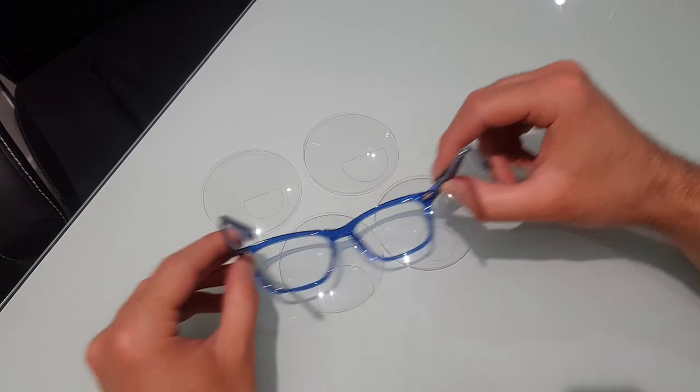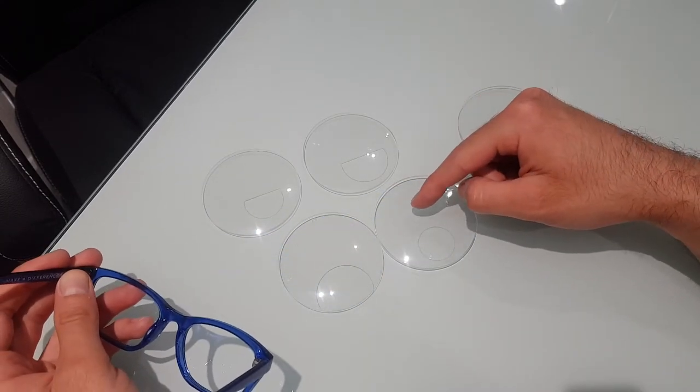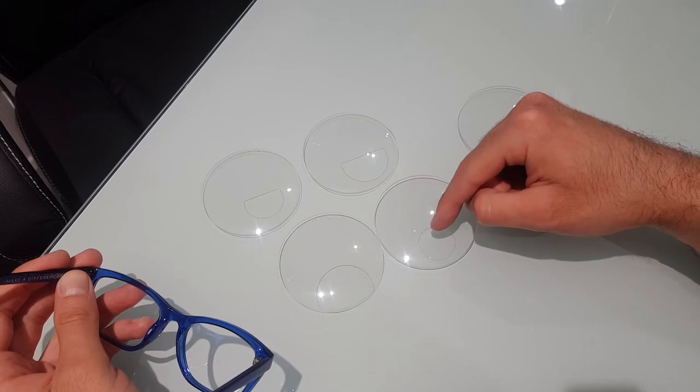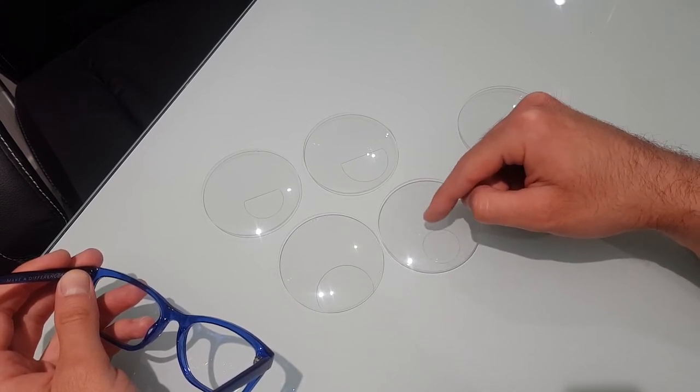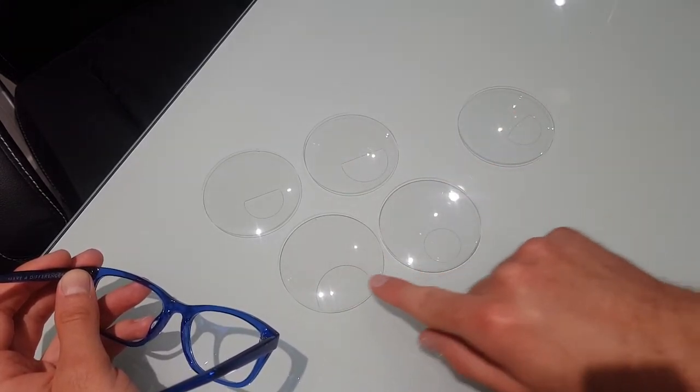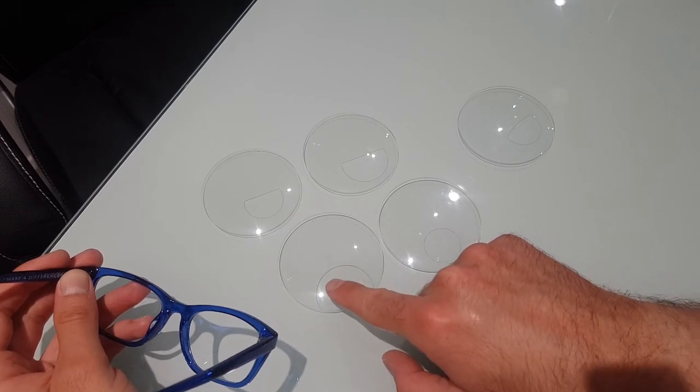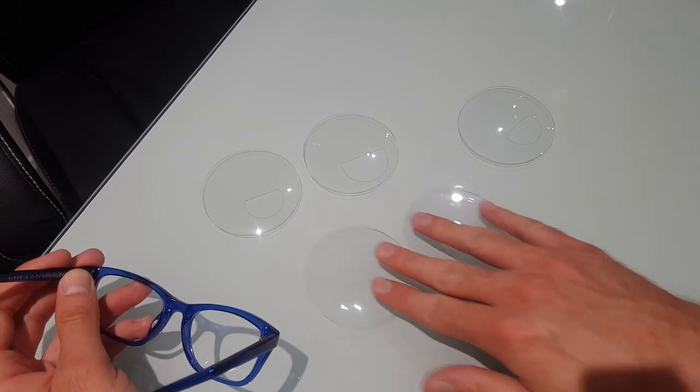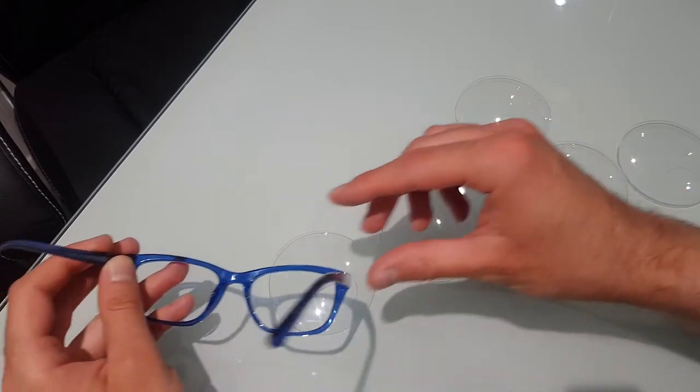One of the things you'll find with a round seg is that when your eyes drop down from looking at the distance to the reading, your eyes aren't met with instantly a wide field of vision. As your eyes come down, the vision width will widen because you're starting at the top edge of the circle. And as your vision comes down, the vision widens here. So that's obviously different to something like a D-seg.